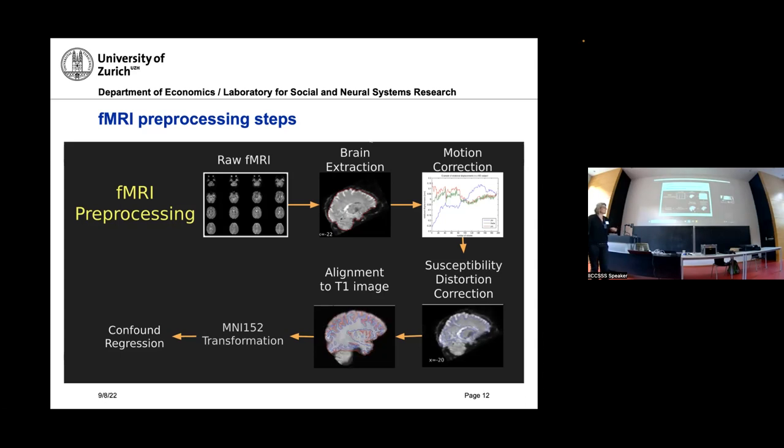The next thing is what I said before, right? There might be something really strange either in the scanner or in the participant, and really tiny things are enough to cause susceptibility distortions. I will show you a better example than this in a minute.